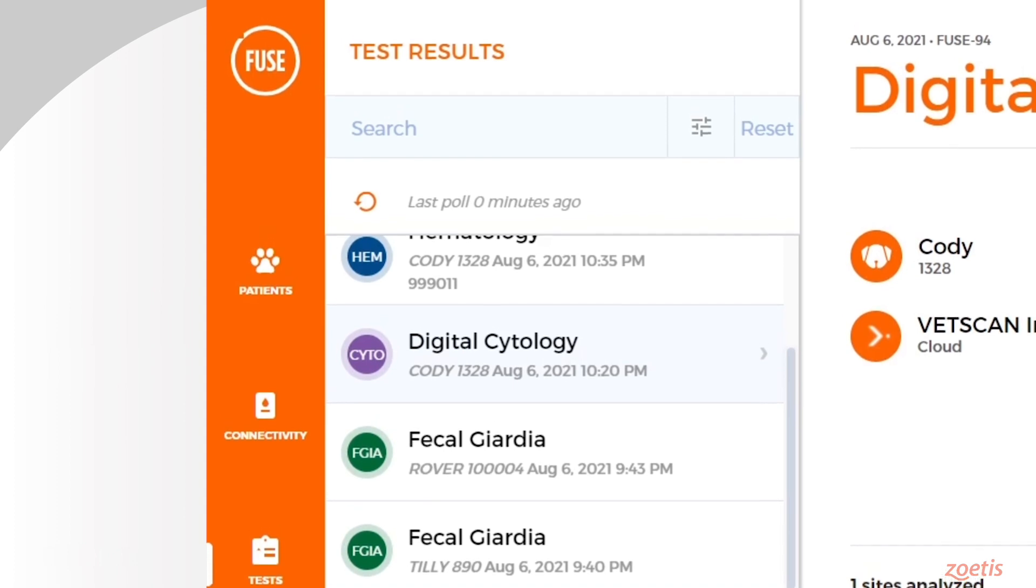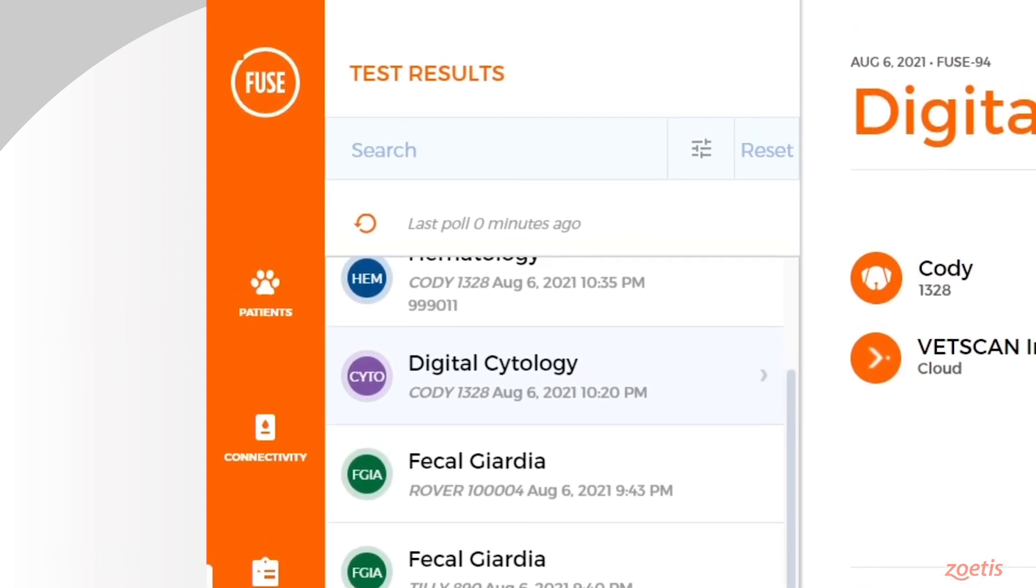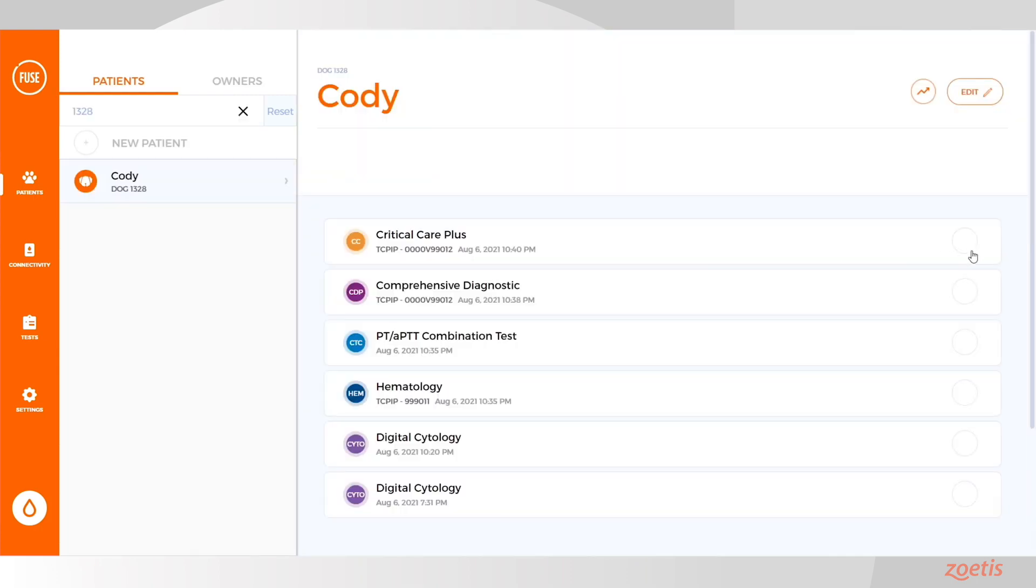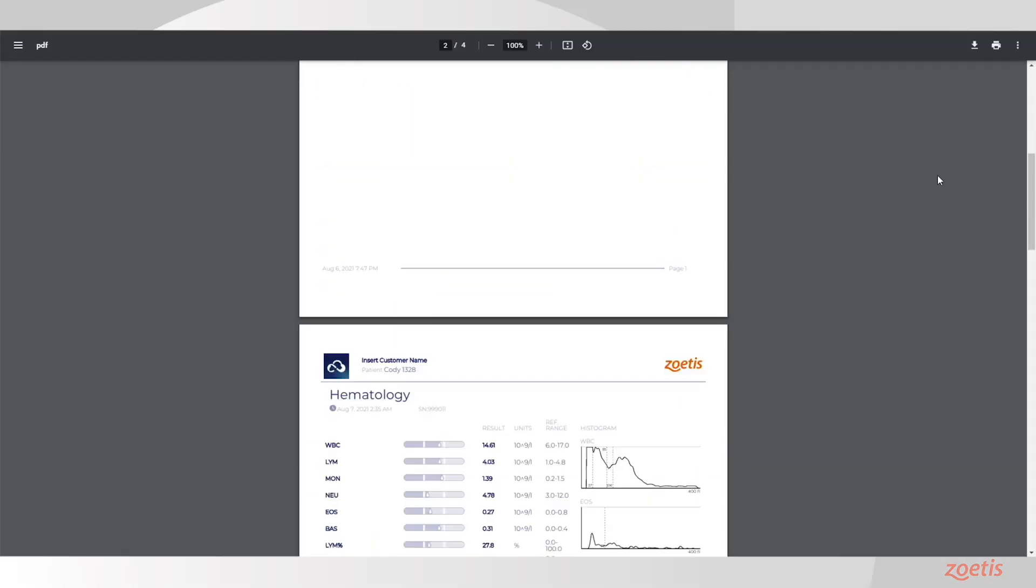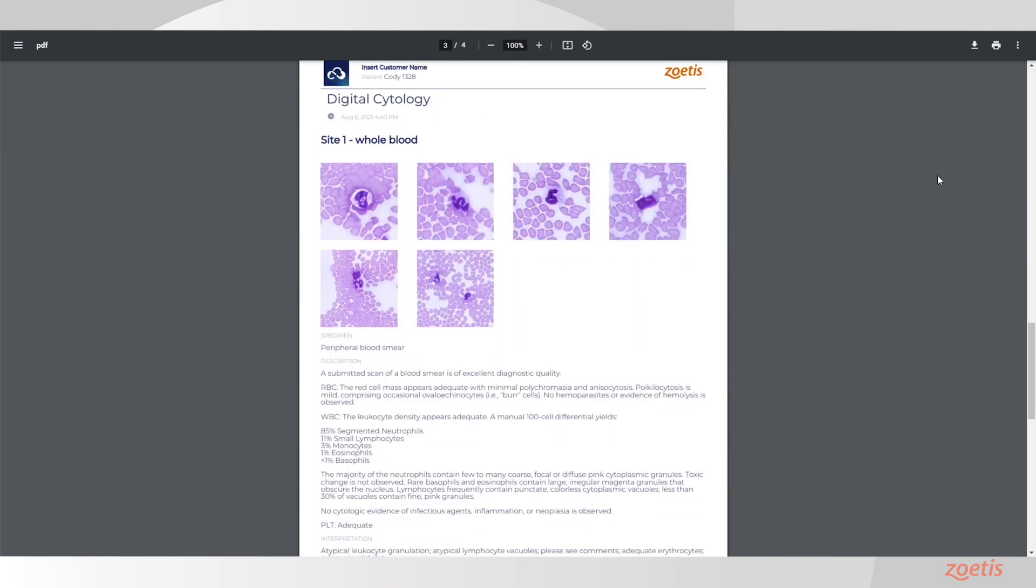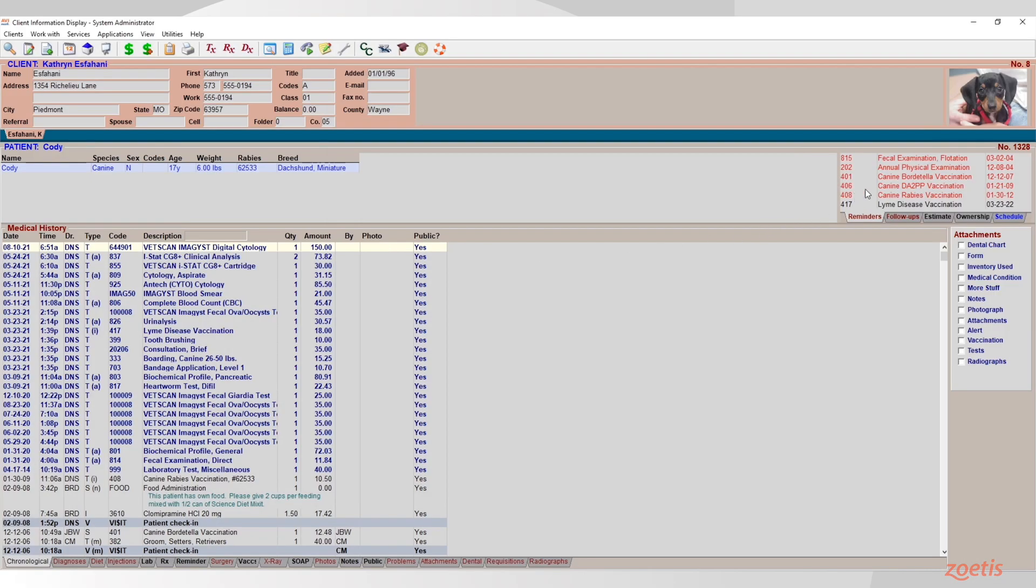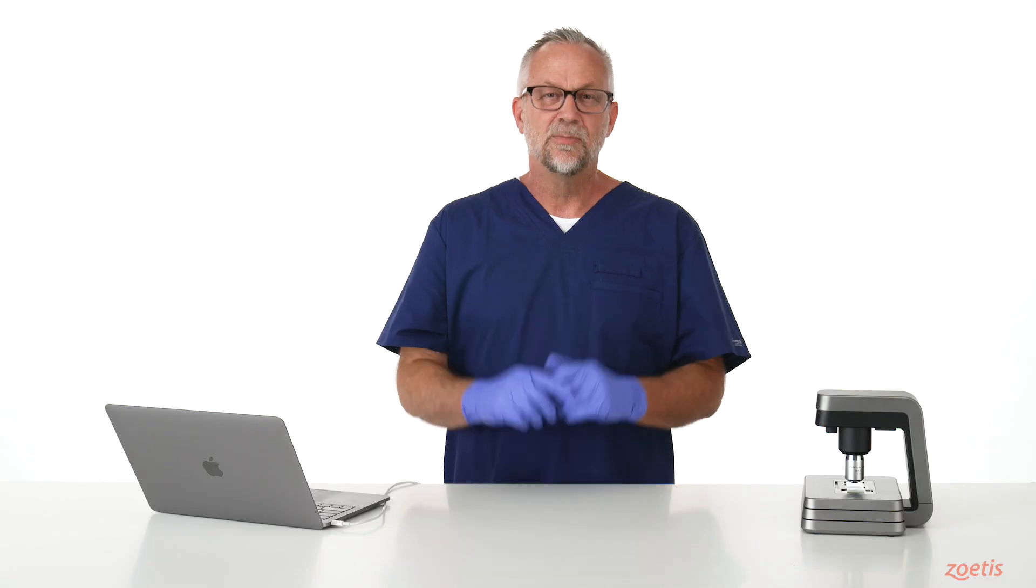Once the results have transferred over, the report can be accessed from within VetScanFuse, next to other diagnostic results. And finally, the report is sent to your patient information management software for Cody, patient number 1328. This completes the test order.